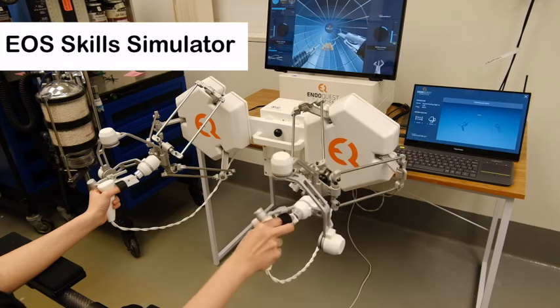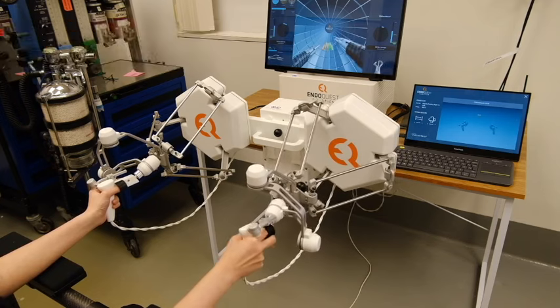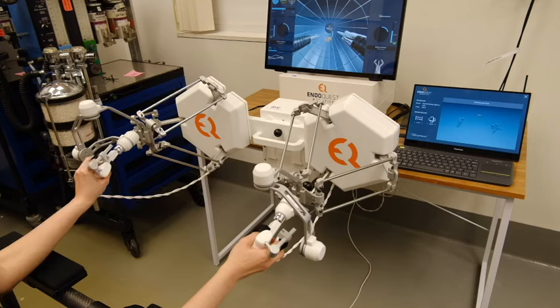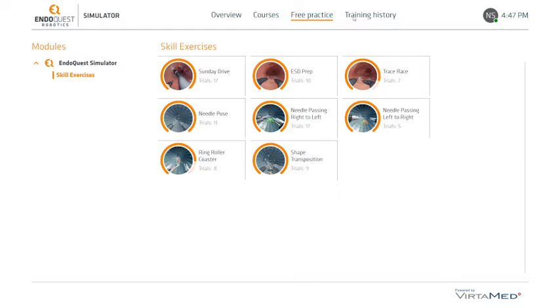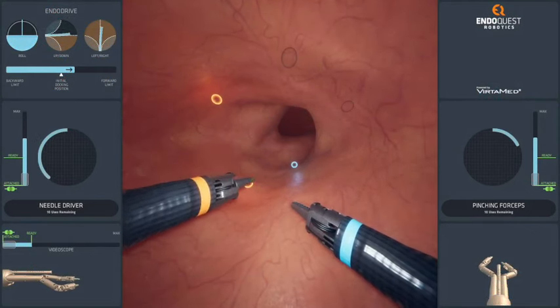The ER Skill Simulator is designed to help operators develop endoluminal robotic skills. The operator can manipulate the handles and foot pedals on the console with a virtual experience that mimics endoluminal robotic maneuvers. The simulator currently offers 8 training modules addressing fundamental endoluminal robotic skills.